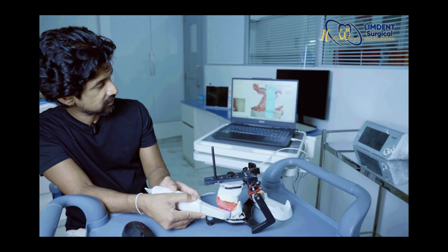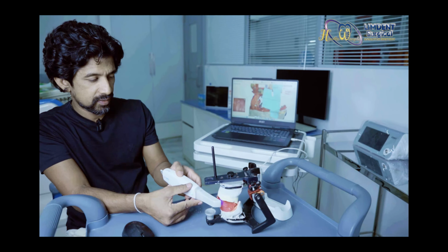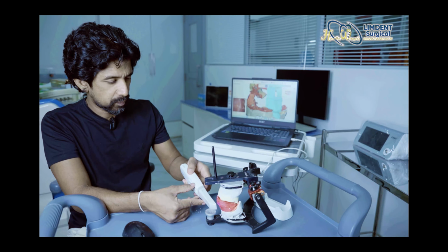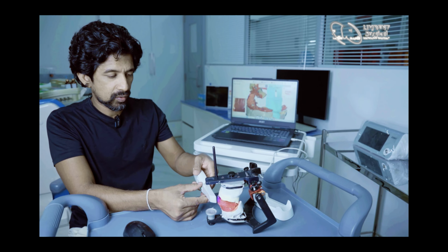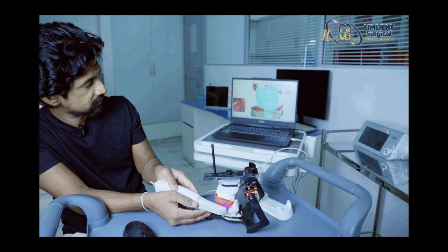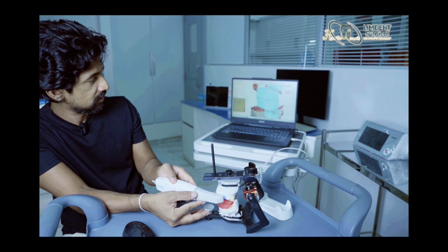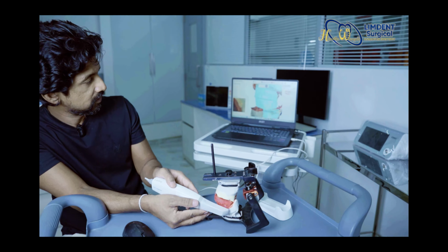Always make sure that you gather the data with the upper and lower jaw bite blocks in place, the way you mounted them on the articulator. This is very important for several steps that you'll come across when the technicians or yourself are going to design the final prosthesis. This data collection will be collecting the data from three different sites.